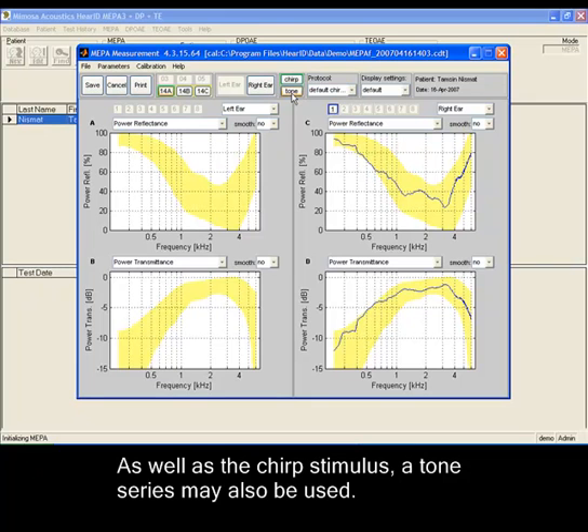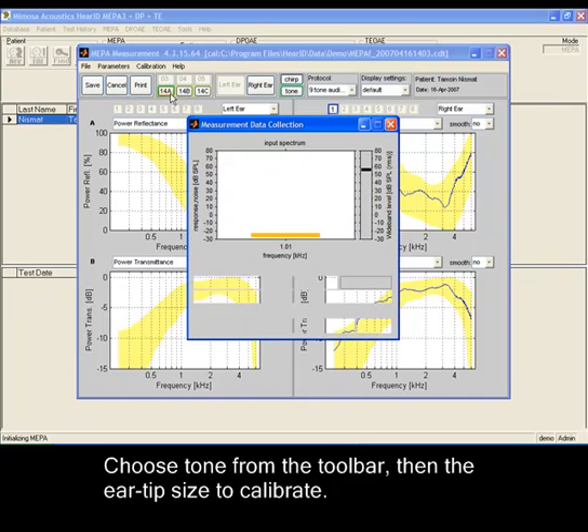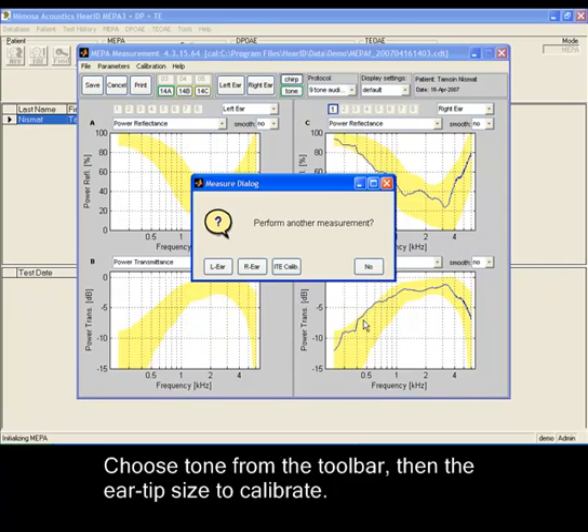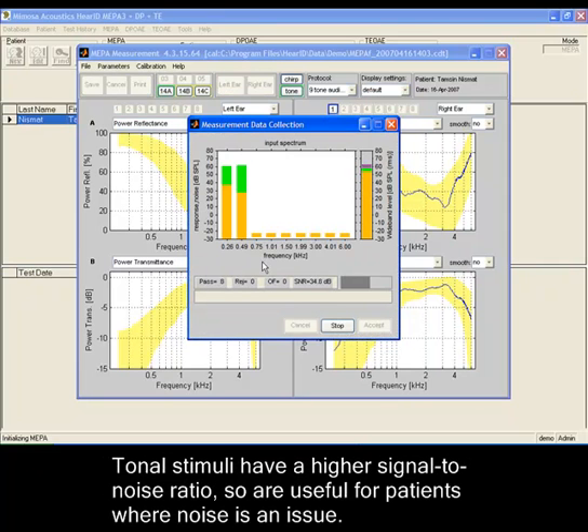As well as a chirp stimulus, a tone series may also be used. Choose tone from the toolbar, then the ear tip size to calibrate. Tonal stimuli have a higher signal-to-noise ratio, so they are useful for patients where noise is an issue.